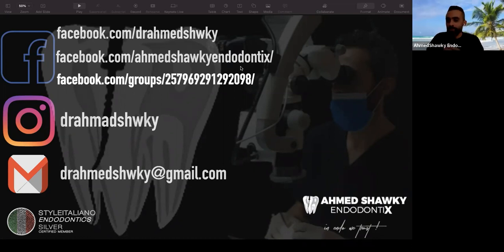That's completely in line with the option that I gave, that sometimes we cannot achieve patency from the beginning. So maybe we can start with the pre-flaring, no harm in that. We start with the pre-flaring, and sometimes in difficult cases we go to body shaping also before the termination of the working length even. So this will perform some sort of gross debridement in the coronal part, reduction of the coronal bacteria, so as not to be pushed. And this is one of the advantages of the crown down, that I pre-flare a reservoir for the irrigation, and this will minimize the bacteria and debris that can be pushed down. So I completely agree with you that sometimes in necrotic cases, we prefer to pre-flare and shape the body of the root canal before we go down to the full working length. I agree with that.